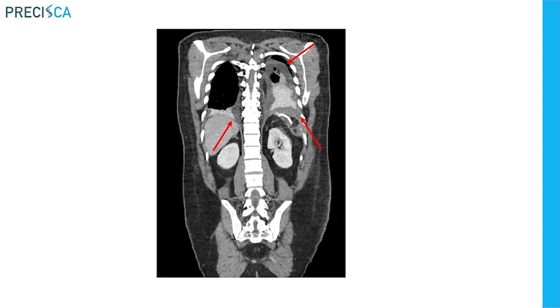Now the lung, because the patient is lying on the table, the fluid now can shift, just as it shifted when we moved the patient on the left side. So it's now surrounding this lung tissue, which is compressed and denser, so it's white here. And the fluid goes around the lung. It is in the pleural space. On this other side, there's a smaller amount of fluid, but you could see that the detail would be better on a CT than on an X-ray.